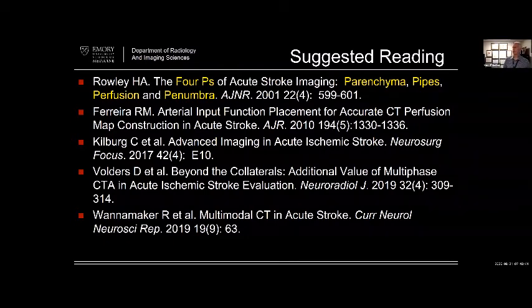Yeah, we do have a stroke algorithm, and I practice at some different places that have a little bit of a different approach. Within that stroke algorithm, they leave themselves wiggle room for a particular patient in a particular situation. So I will say that most of the time here, I do end up with what you just said: non-contrast head CT, then CTA head and neck, and if they're in the thrombolytic window, typically CT perfusion. That is typically what is done here.